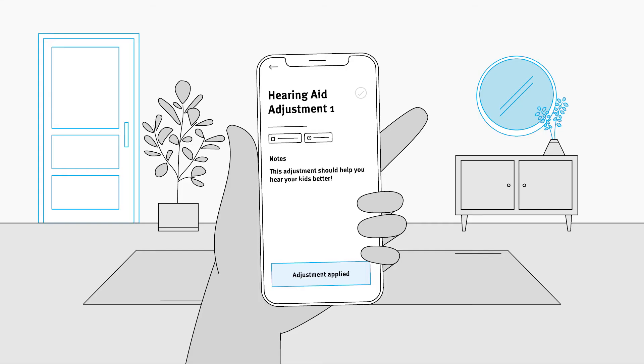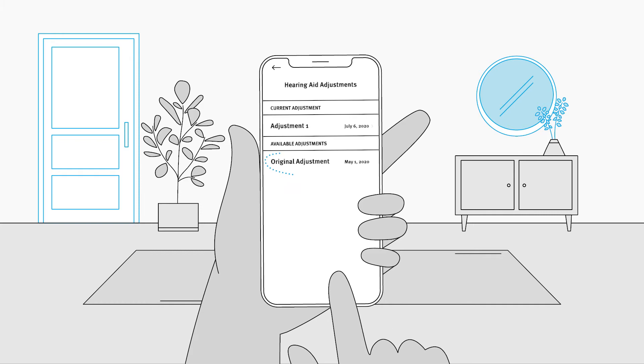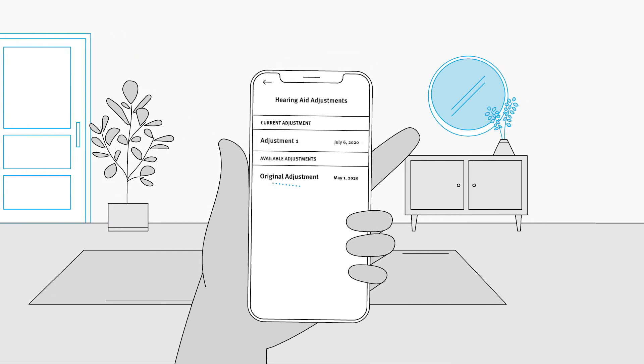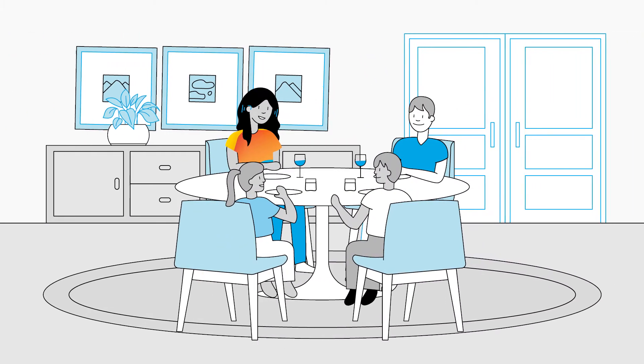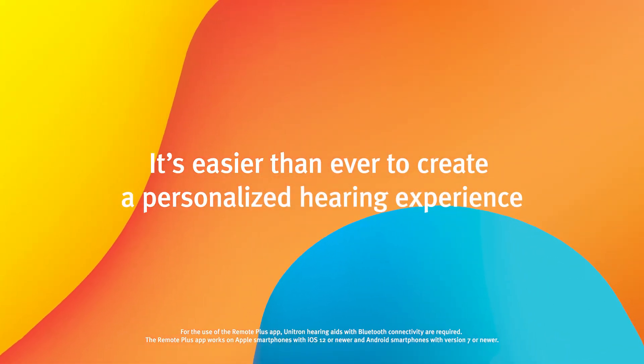Clients can apply updates without worrying about losing their current settings. If something doesn't sound right, they can always revert back to an earlier adjustment. So whether your clients are at home or on the move, with Remote Adjust, it's easier than ever to create a personalized hearing experience.